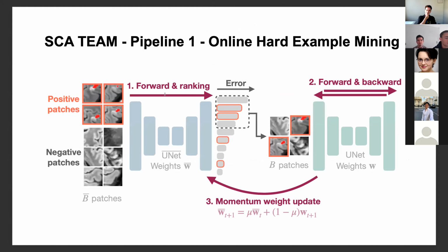Our approach is based on a 3D U-Net that is applied patchwise to the images with patches of size 32. The challenge dataset is very imbalanced, as only 1 in 20,000 voxels is positive. In this case, it is common to oversample patches containing the annotations, but when doing so, one has to choose the correct amount of oversampling.